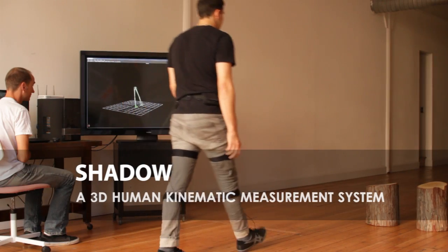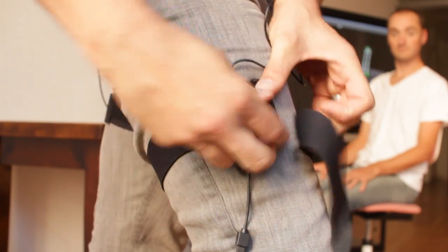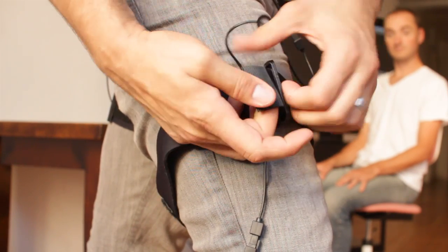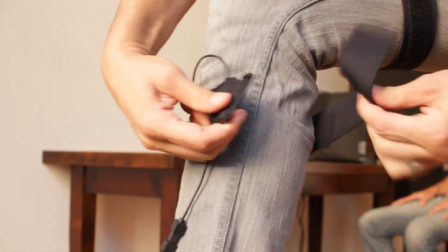Introducing Shadow, a wearable kinematic sensor system for measuring 3D human body motion. The Shadow system uses custom motion node IMU sensors embedded in neoprene straps with a Wi-Fi enabled controller and data logging capability. Pressure sensing shoe insoles are included as well.